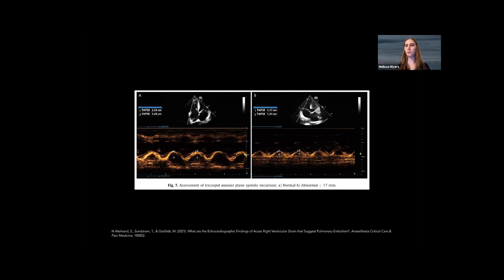TAPSE is very useful because at my facility, as at many others nationwide, we are starting to send more patients with PE home, and I've incorporated this into my practice before discharging such patients — I want to confirm I'm not seeing early signs of right heart dysfunction. What's great about this is you'll see it before you see dilation, before you see a McConnell sign or D sign, before hemodynamic changes develop. TAPSE is straightforward to do because all you're using is M-mode. This image is from an article by Dr. Gottlieb et al., used with the permission of the authors.